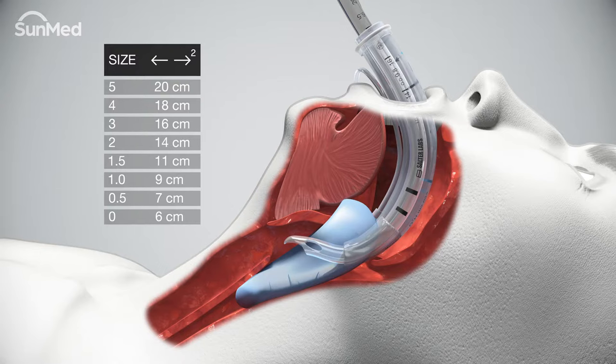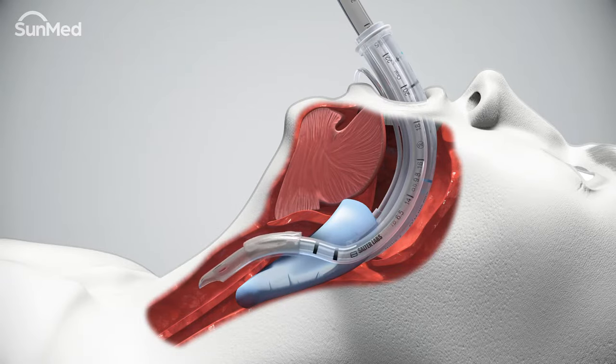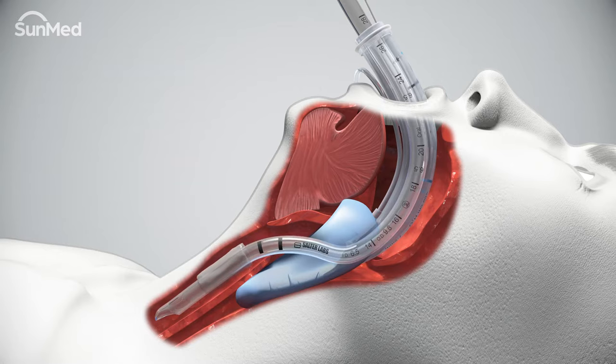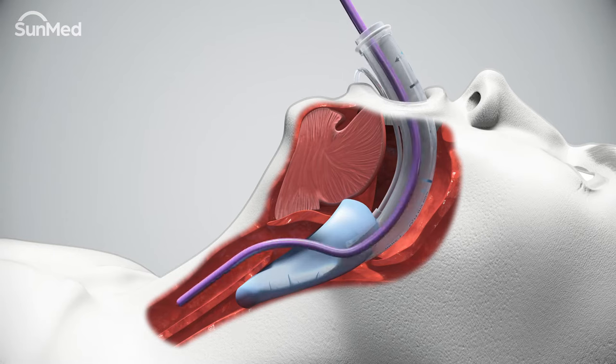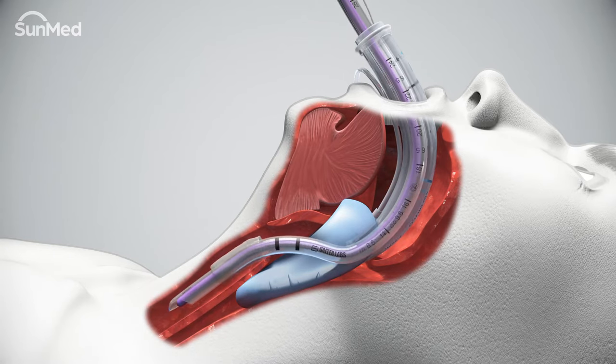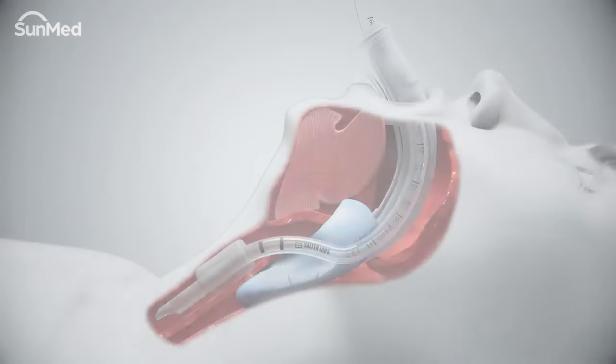This will place the tip of the endotracheal tube proximal to the opening within the mask cavity. There are several techniques used to advance the endotracheal tube into the trachea and through the vocal cords — using a fiber optic endoscope or bougie are common techniques. Follow your standard protocol for advancing the endotracheal tube, then inflate the cuff and verify adequate ventilation.